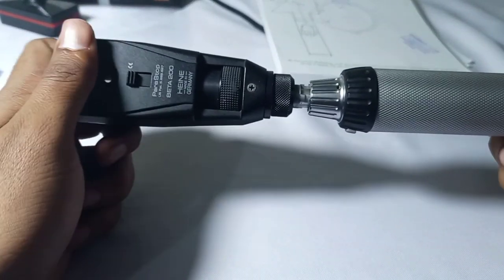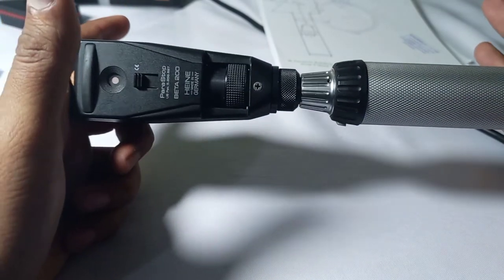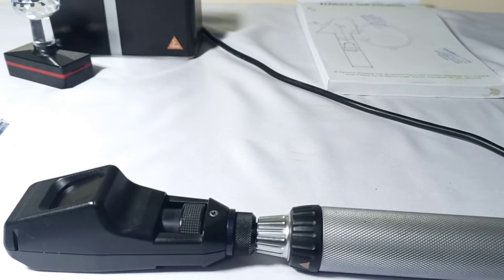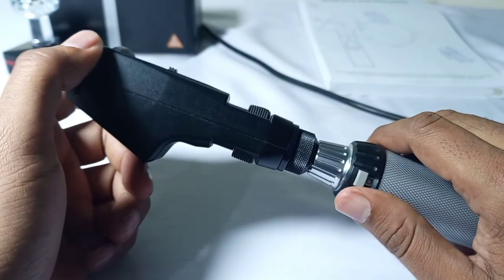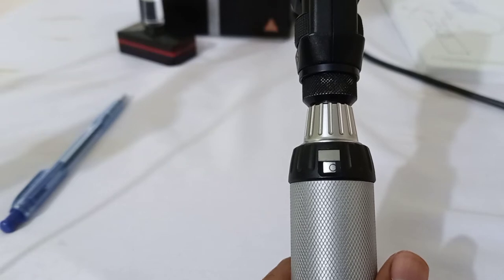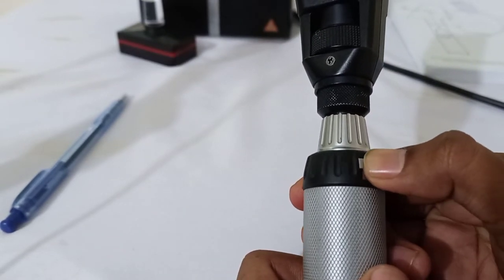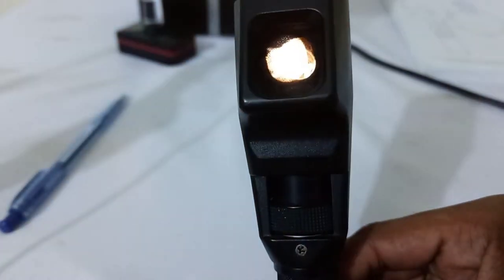Now we will simply fix the handle of the retinoscope and the head of the retinoscope together. To switch on the retinoscope, I have to reduce the lights in the room. You simply press this button and rotate it, and your retinoscope is on — you can see.